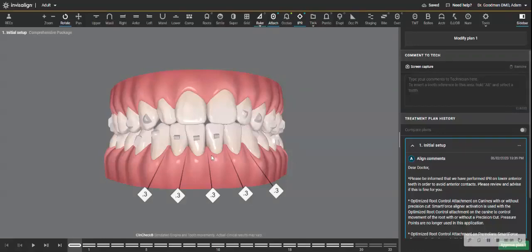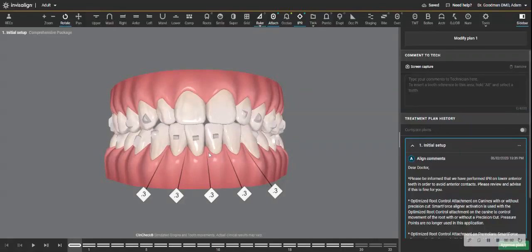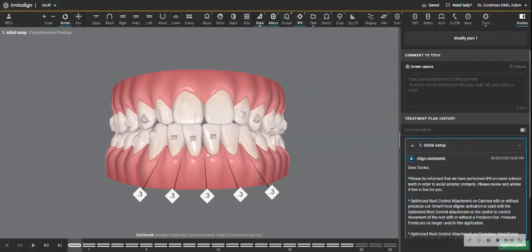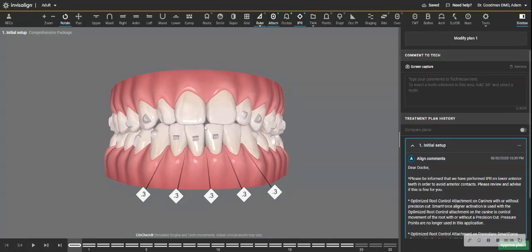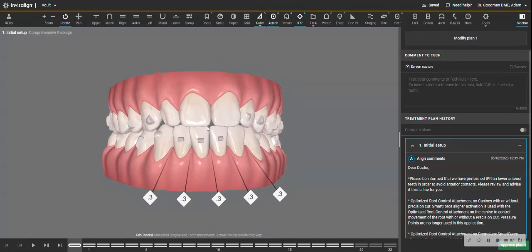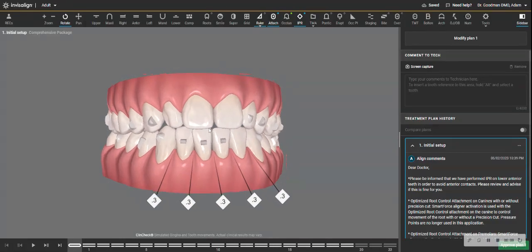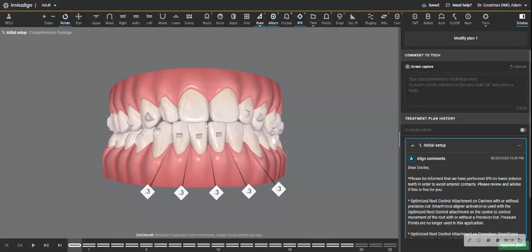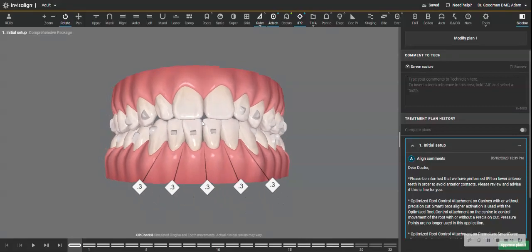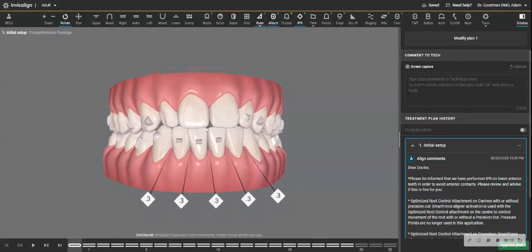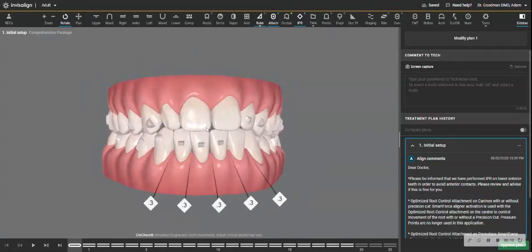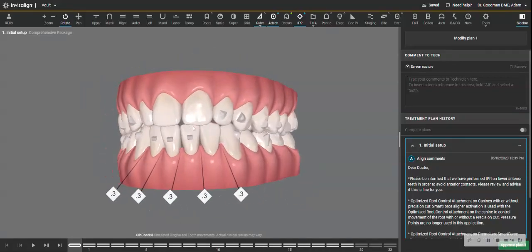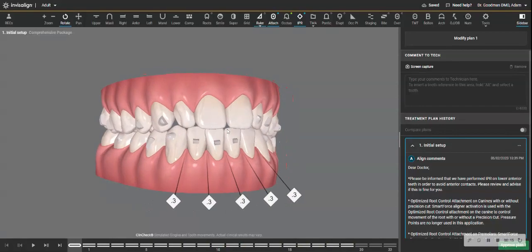I decided to record myself making ClinCheck modifications on just a random case. When I send a case into Invisalign, I actually don't give them that much information. I work off this because it's a great diagnostic tool.